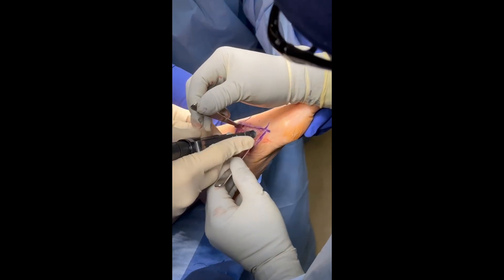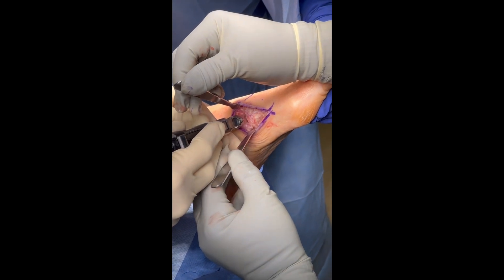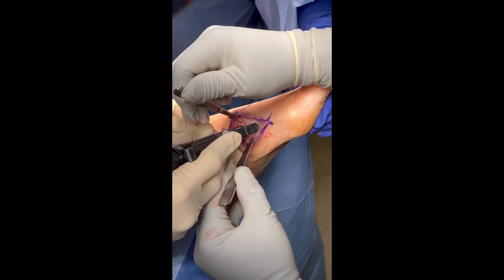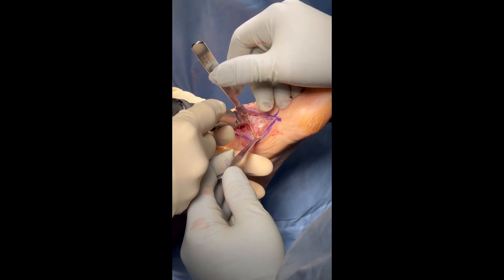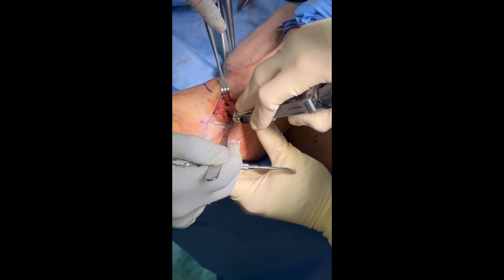Joint preparation is then performed. The author performing this case prefers flat cuts with a microsagittal saw. Several of our authors prefer to utilize sharp osteotomes and curettes for joint preparation. Joint preparation is then performed in the second and third TMT joints in similar fashion.